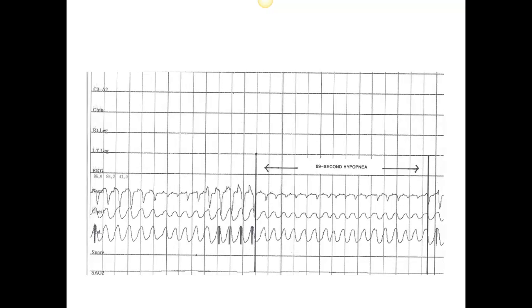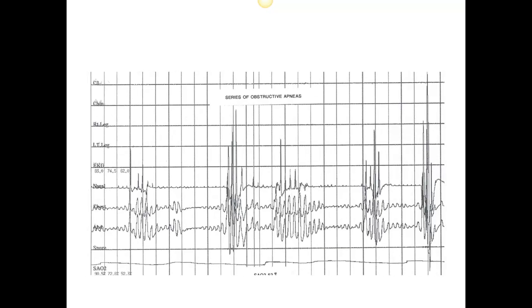Here's an example of another hypopnea. Hypopnea is a reduction in airflow with continual effort. Here's a demonstration of a series of various obstructive events, and this event here actually looks like it may be able to be scored as a mixed event, because it looks like there's a section where there is very little effort, and then we definitely see the effort return.